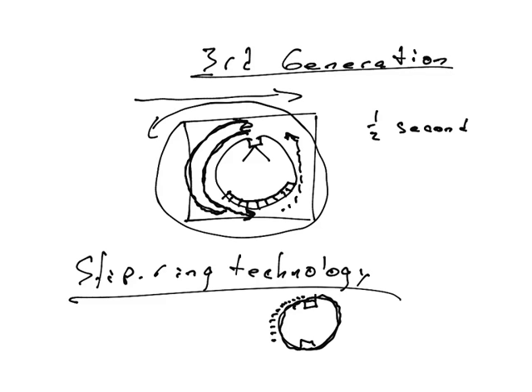Well, just outside of that, which is rotating, is basically like a brush of wires, very thin cables. It looks like a brush, filaments. Since they're made of copper, since they're made of metal, they could send power through. The current can run through this brush, these filaments.